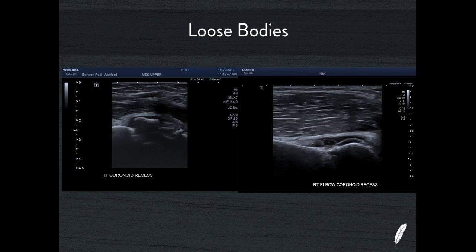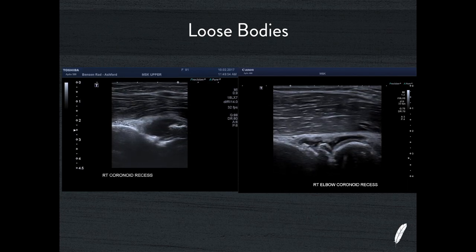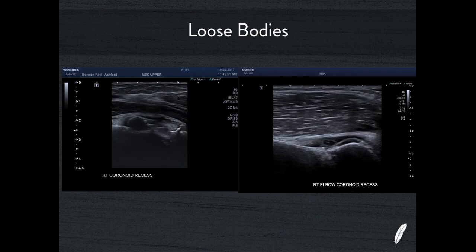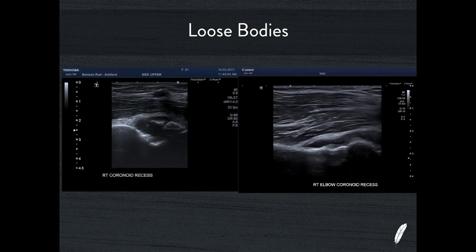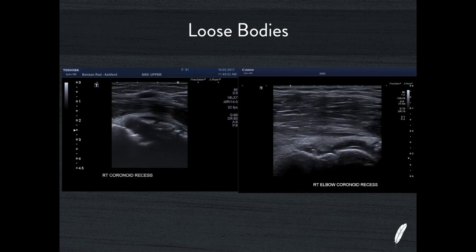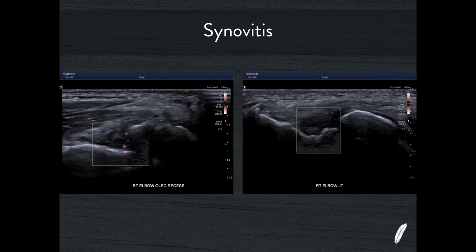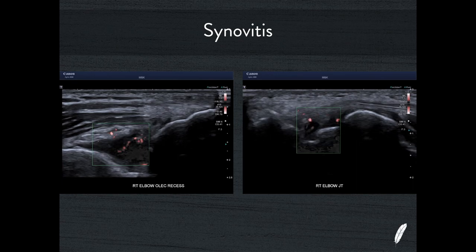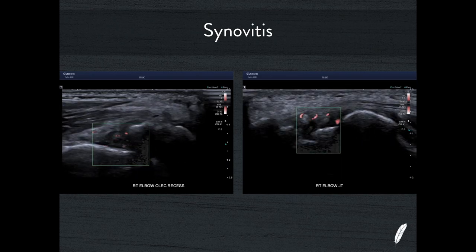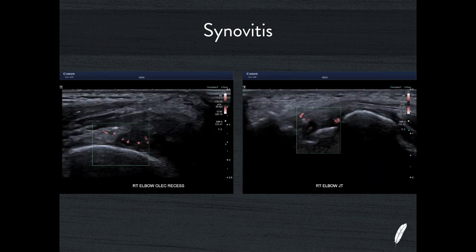When looking at these joint spaces you can also occasionally see loose bodies. In an elderly patient with osteoarthritis these loose bodies will be associated with that osteoarthritic process; in a younger patient consider synovial osteochondromatosis as an alternative diagnosis. Make sure when you're looking for a joint effusion you're also looking for loose bodies and considering synovitis. Once you see a joint effusion or thickening of the joint capsule, test this with colour Doppler to see if you've got hyperaemia. Using SMI here you can see quite a lot of vascularity of this joint capsule — this patient has synovitis, not just a simple joint effusion, which makes me think about a rheumatoid condition.